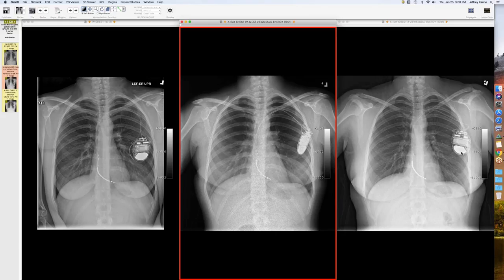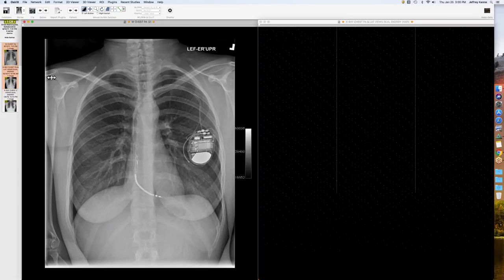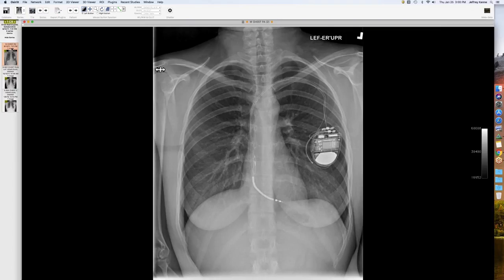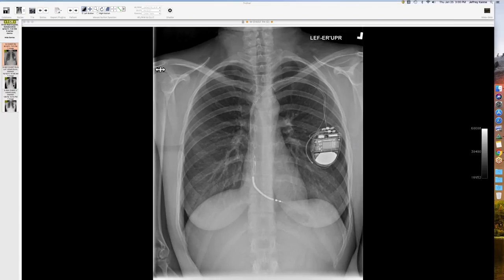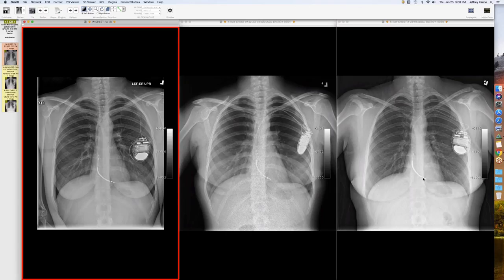I've seen them flip along the transverse axis too — a lady gardening bent down and it flipped. We've also seen twiddlers where they play with it and it rotates clockwise. This is just a different orientation. One lead may have pulled back a little bit, but as far as known, it was still capturing.